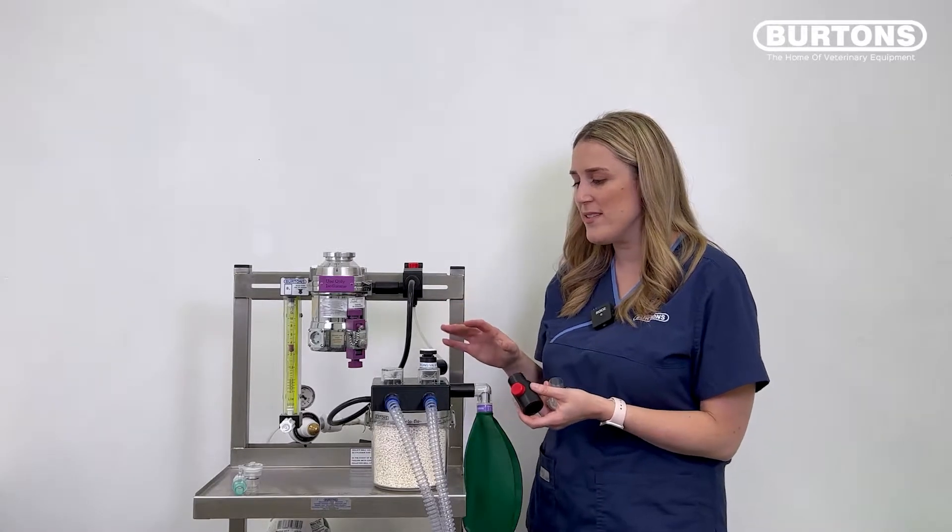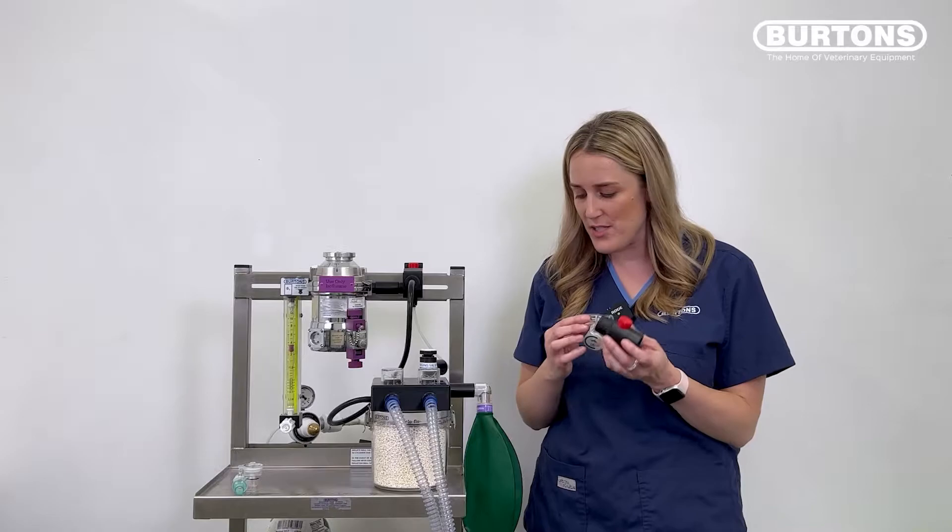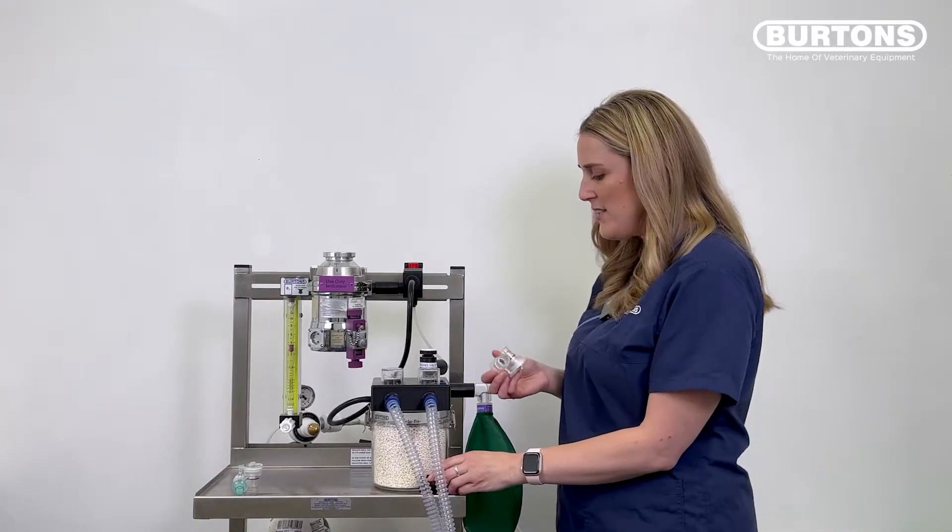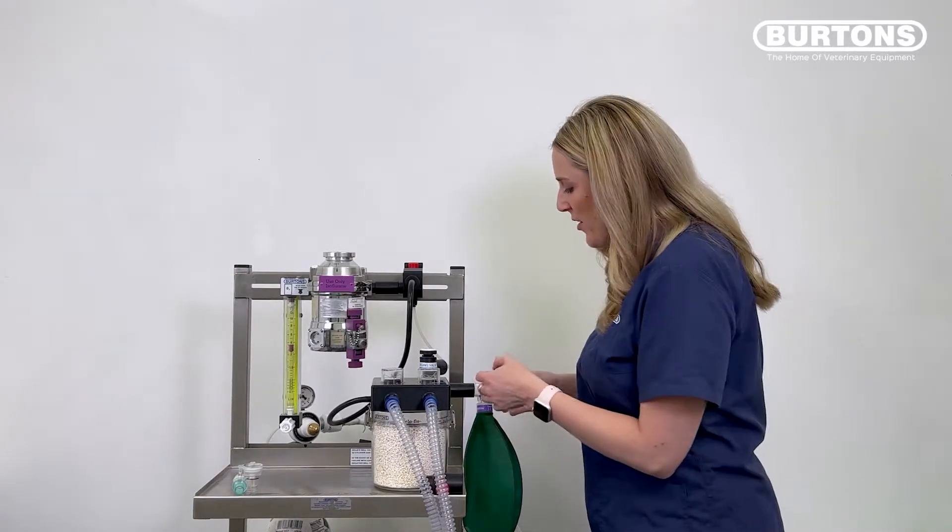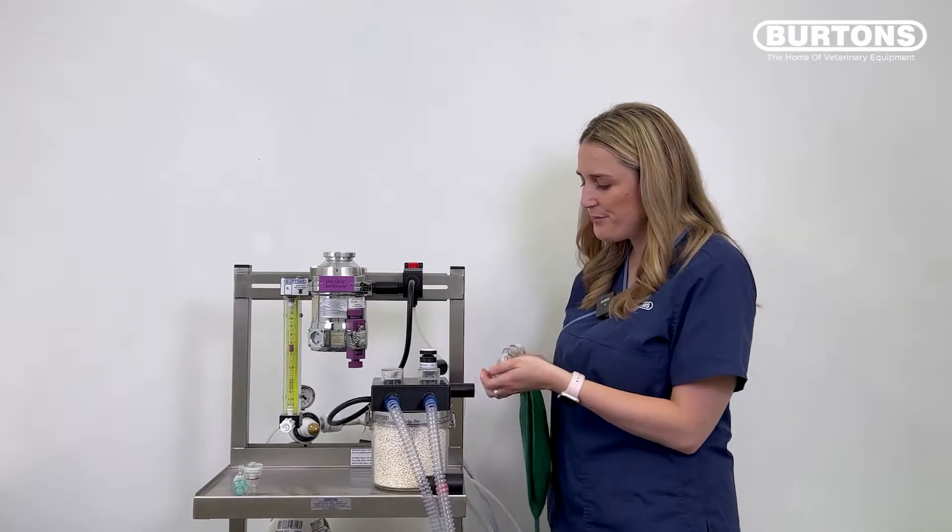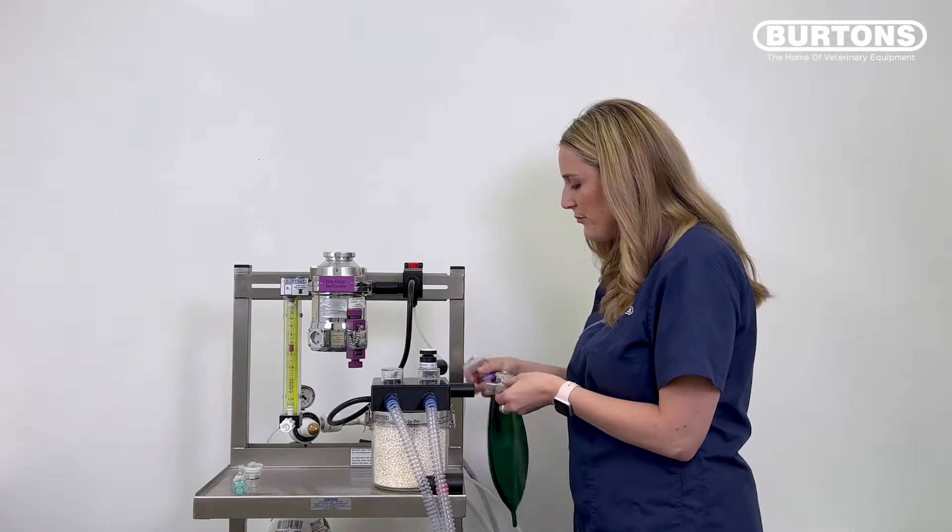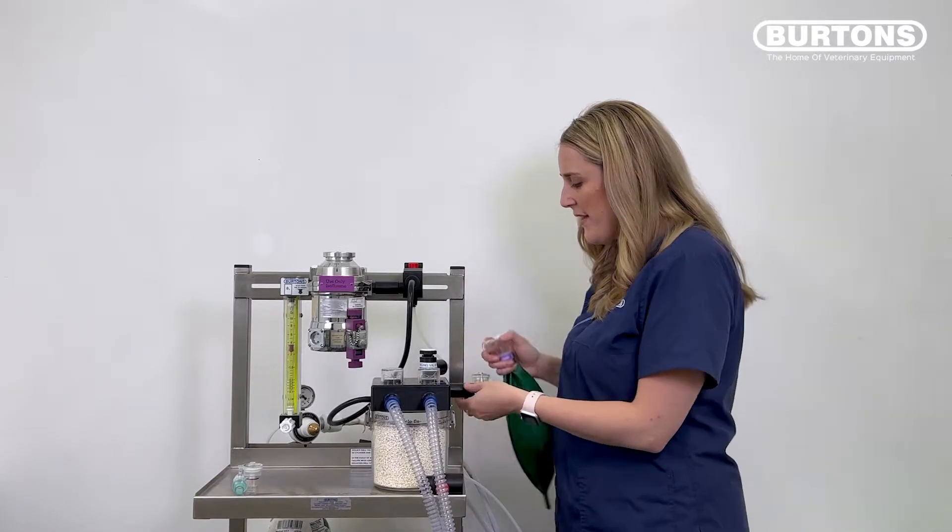So what I have here is a circle breathing system and I'm just going to go and attach our accessories. First of all I have the in-circuit manometer. I'm just going to take off the reservoir bag and attach the manometer and then attach the bag back on.